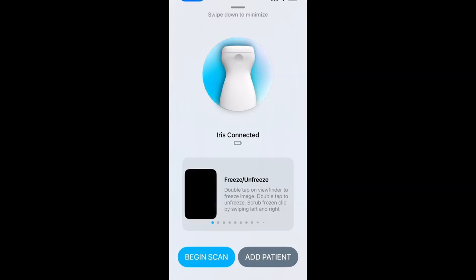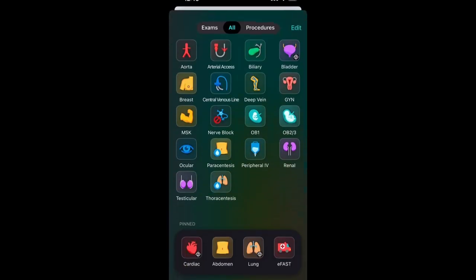Let's plug in and see what we've got. When you connect the Echo Iris, the first screen lets you swipe through a quick intro on how to use the probe, or you can choose one of the buttons at the bottom — either begin scanning or adding a patient from the work list. The next screen looks like opening your iPhone with a bunch of apps. You can have pinned presets at the bottom for commonly used ones and all others above. Let's open up the eFast app.